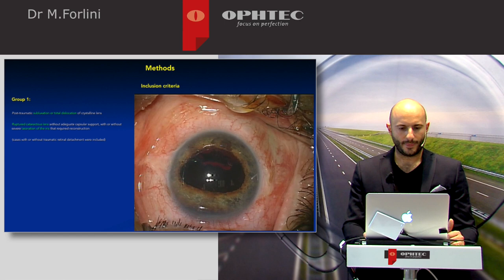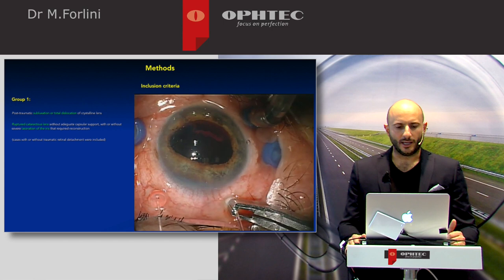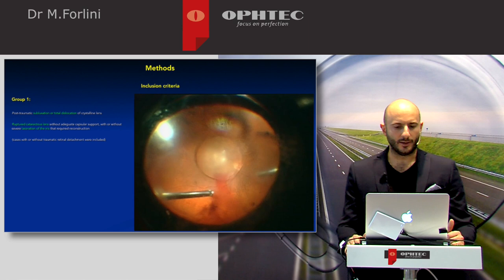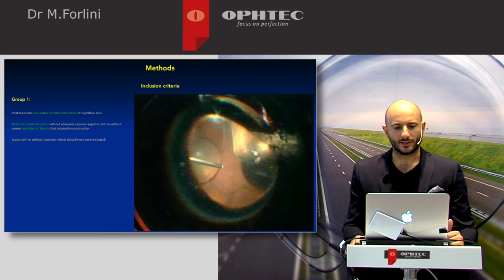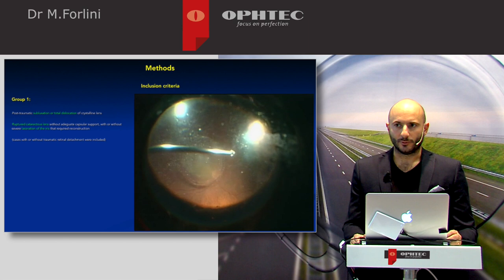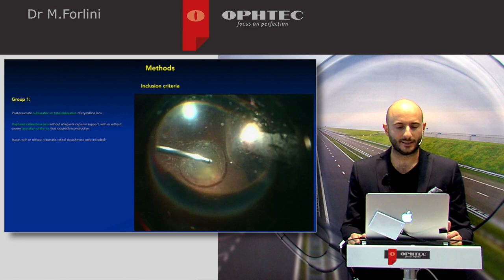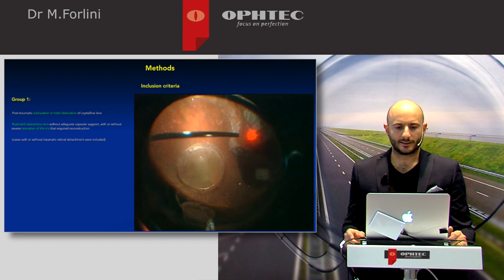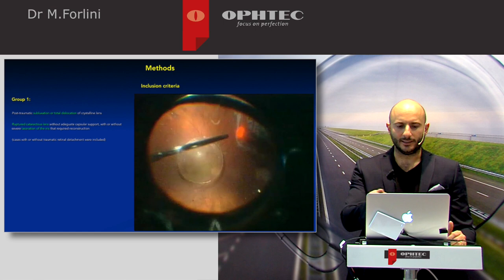Another case — again, a trauma. This was a bottle cork trauma. You can see vitreous hemorrhage; the trauma caused complete luxation of the crystalline lens into the vitreous chamber. The lens is down on the posterior pole, and you can also see iridodialysis. The iris was lacerated with dialysis, but fortunately the retina was not detached. However, there was a very big retinal break, almost 180 degrees. So we performed endolaser and sealed the break with laser.